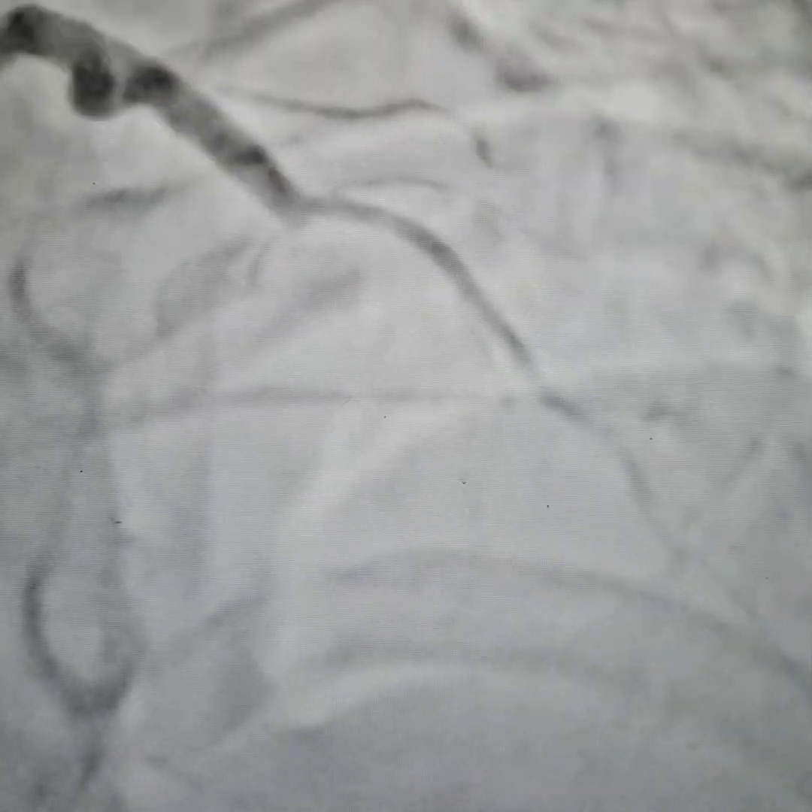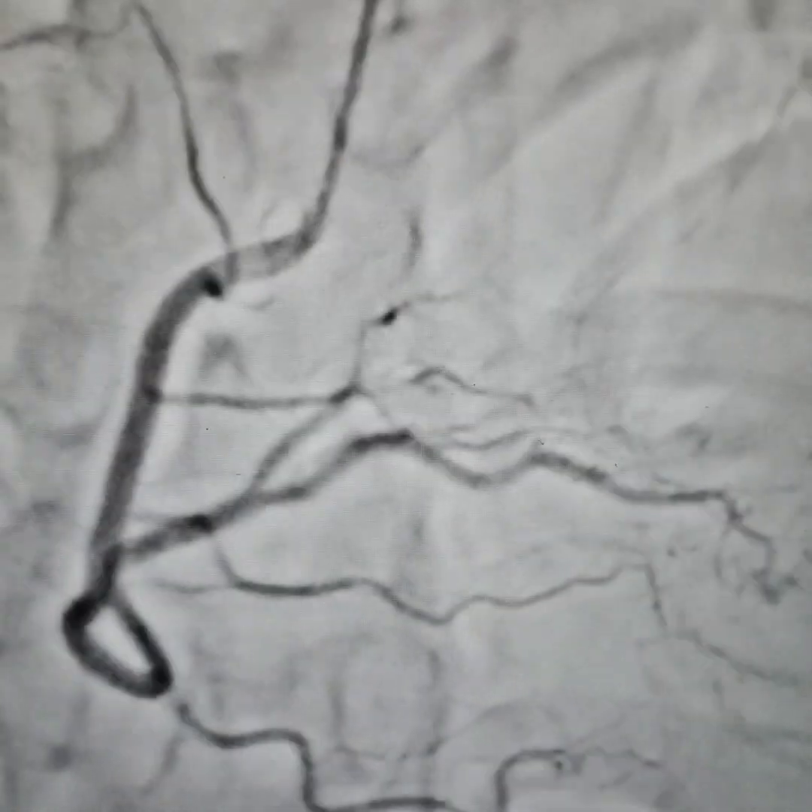This is a case of chronic total occlusion of the left anterior descending artery with a blunt stump and a large side branch. You can clearly see that the RCA and the PDA are supplying collaterals to the LAD.